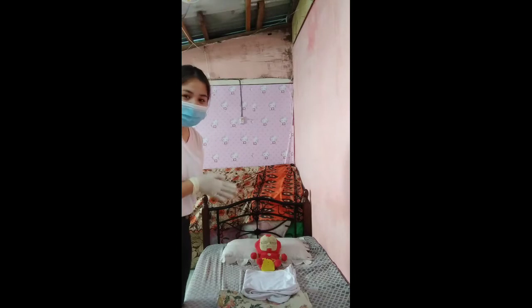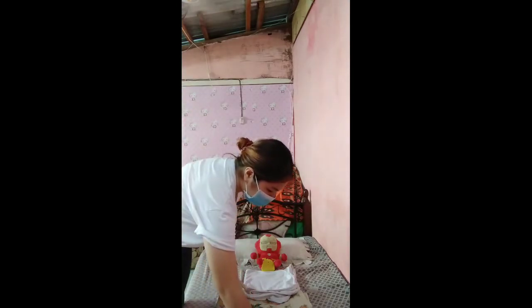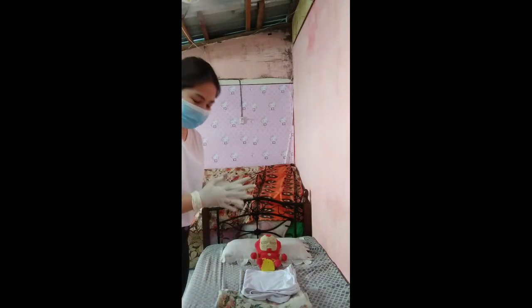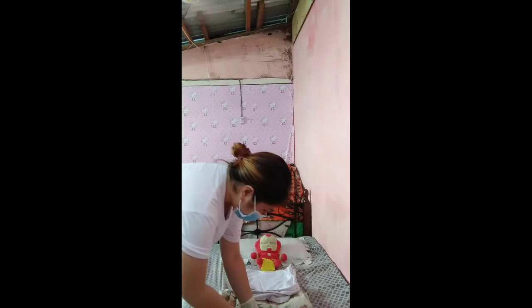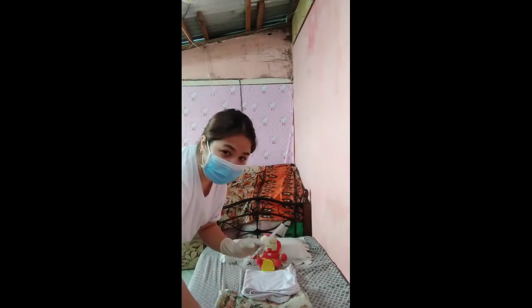After putting the sterile drape on the patient, we need to prepare the antiseptic solution. So I have here an alcohol swab. So after preparing the alcohol swab, we need to put the 10 cc syringe into the port of the catheter. So we have a 10 cc syringe of water here, and we need to put it into the catheter.